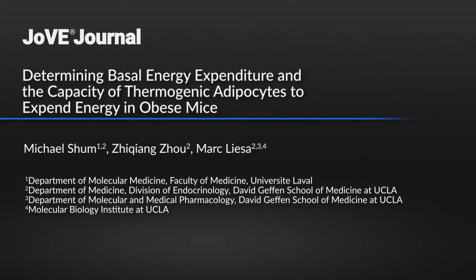This protocol allows a researcher to determine whether there are differences in the energetic balance of mice, which can help identify the physiological processes responsible for a change in body weight. It can also be used to determine the capacity of brown fat to expend energy.